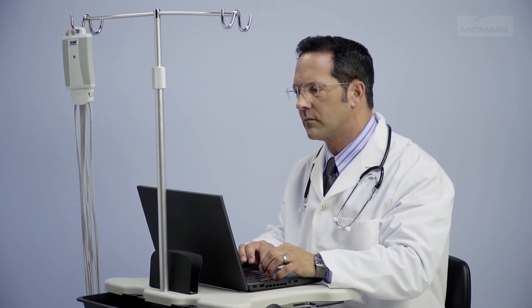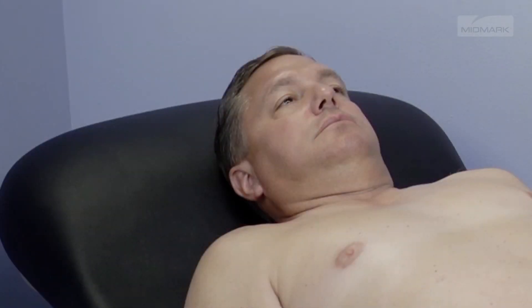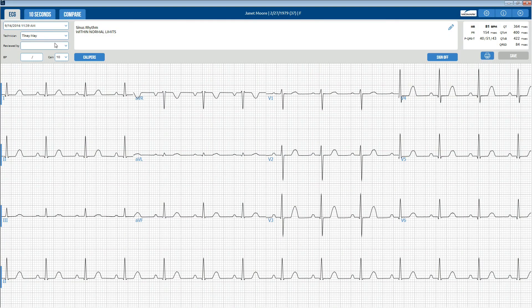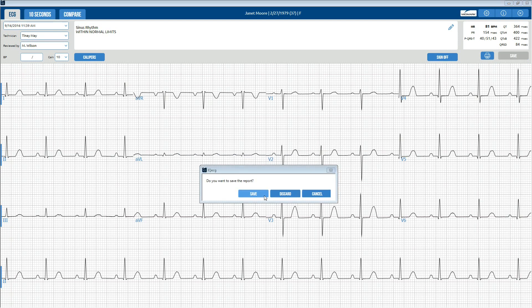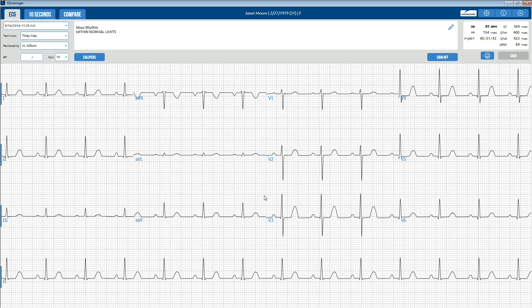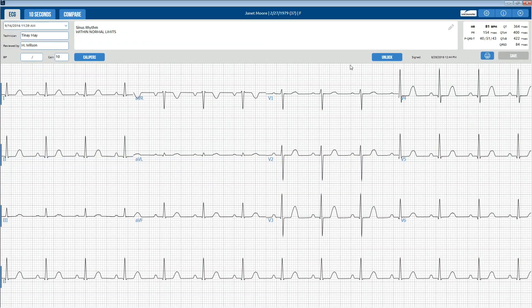All ECG tests must be examined with respect to the patient's overall clinical condition. When you are ready to sign off on the report, enter your name and click the Sign Off button. The date the report is signed, the name of the reviewing physician, and the user name are recorded, and the report is now read-only. To edit a signed report, retrieve the report and click the Unlock button.